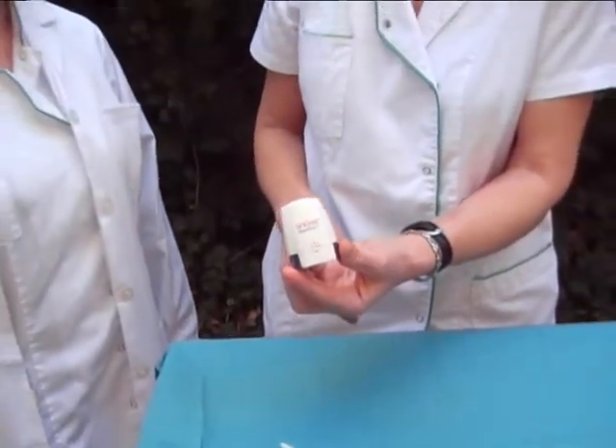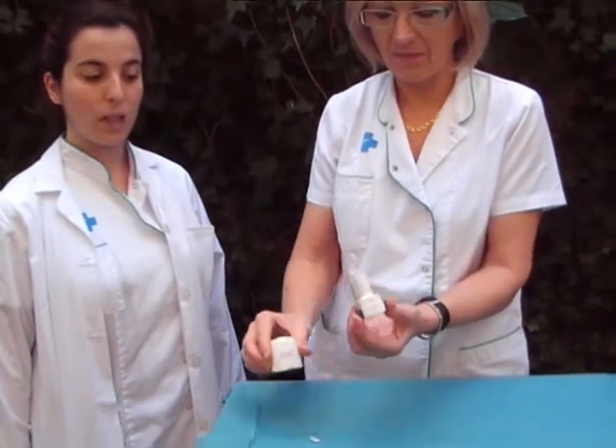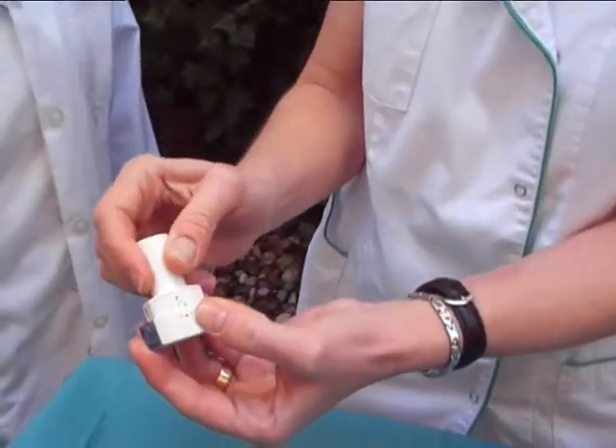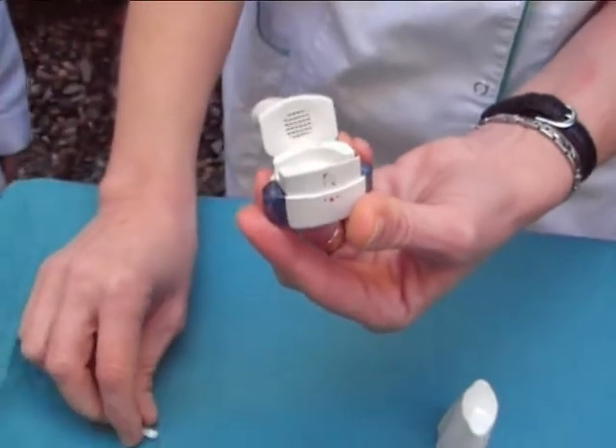First of all, remove the cap. Lift up the mouthpiece while holding the base of the inhaler. Make sure your hands are dry and put the capsule in the chamber.